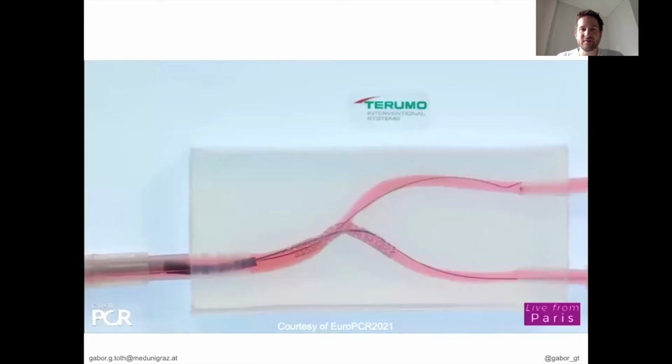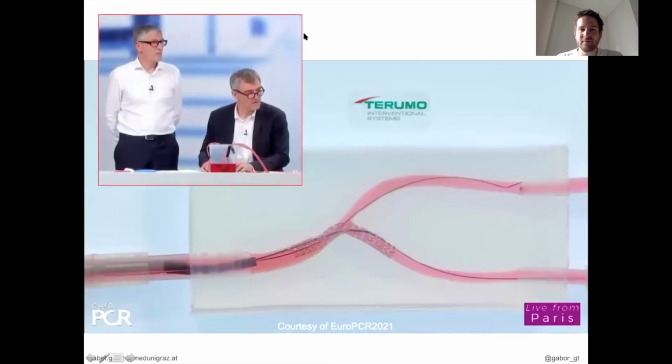Confirming our findings, the best demonstration I have ever seen with proximal stent lengthening was done during a bench case performed by 2 of the greatest bifurcation operators during EuroPCR this year.